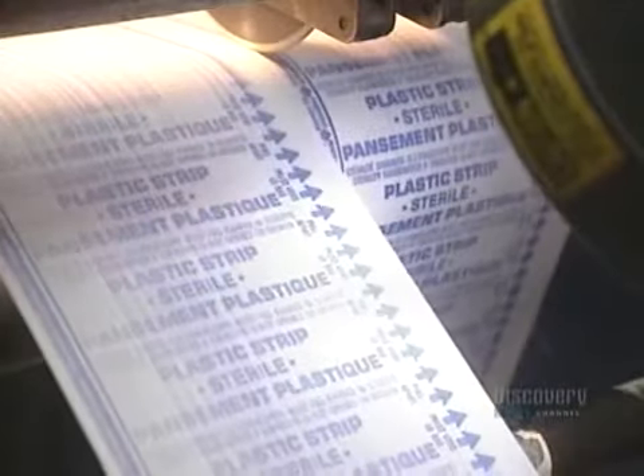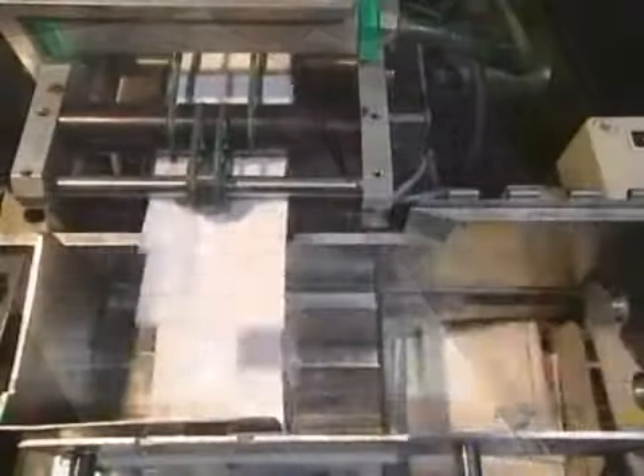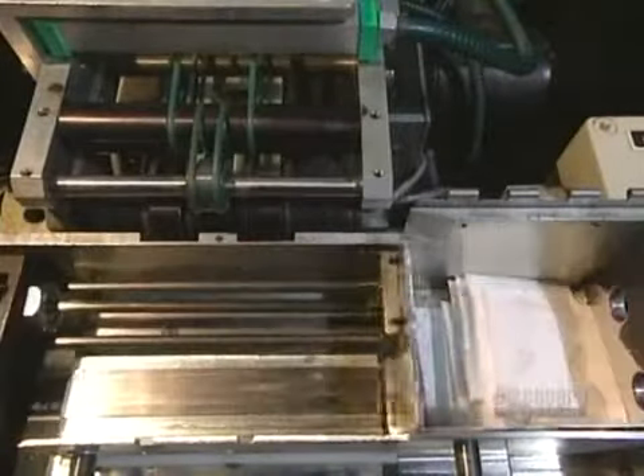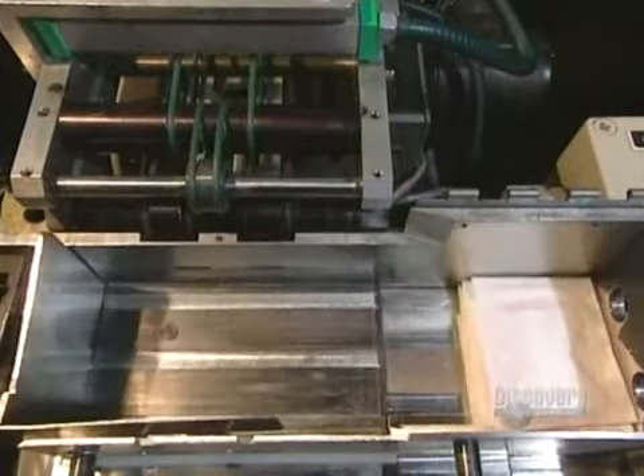Before being packaged, the bandages are finely sterilized 10,000 at a time. Bandages are automatically counted, placed in a chute, and fall into the packaging box. The large roll of ETS fabric seen at the beginning will have allowed them to make nearly 2 million bandages.